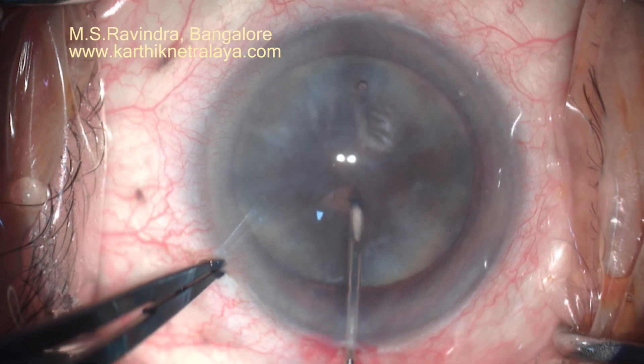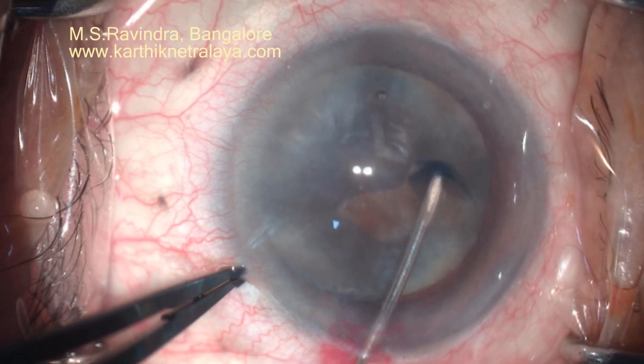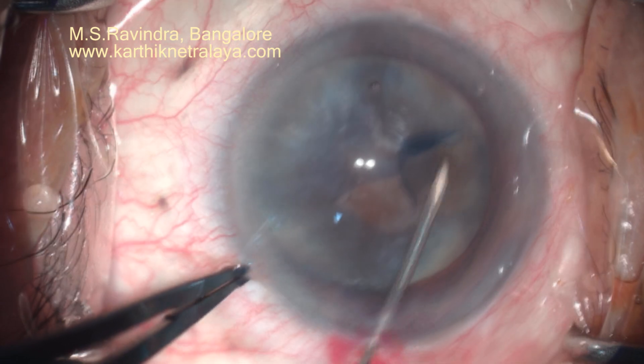Tunnel floor entry, with a viscoelastic-filled entry chamber. There is no leak because the entry is through the tunnel floor.